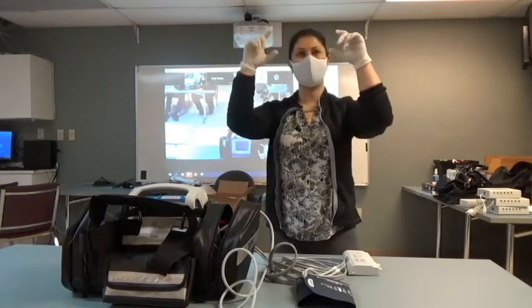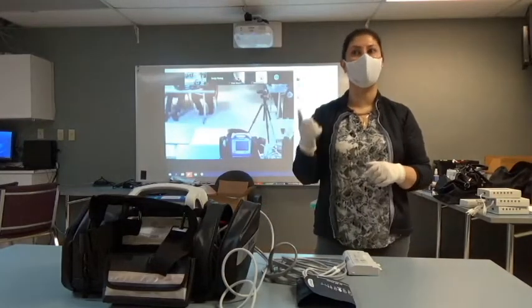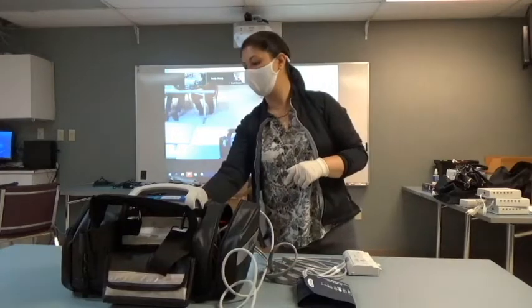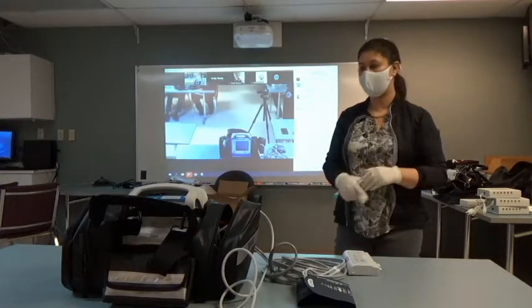The camera takes a picture and saves it into your album so you can retrieve it later. That's your record button. Then you have your blood pressure button down at the bottom. Everybody good so far? Okay.